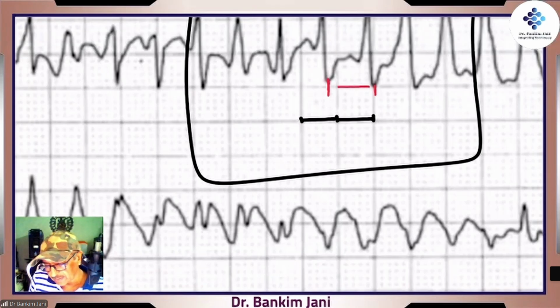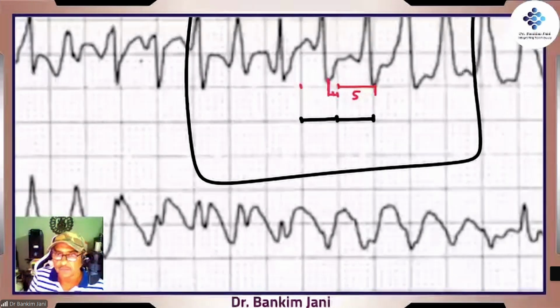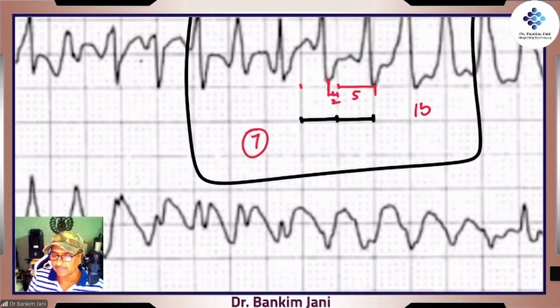यहाँ पे से this is one full box. This is where the other box is there. So this is about 2. You take 2 small squares? 2 small squares. Correct? So total 5 plus 2. So that means we are dealing with 7 small squares. So now you are smart enough.